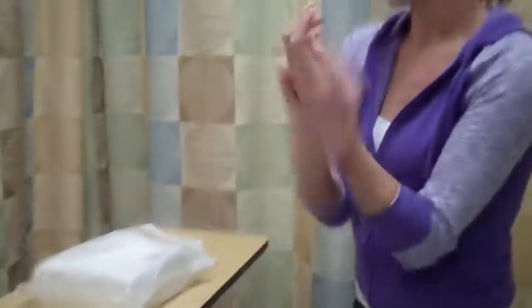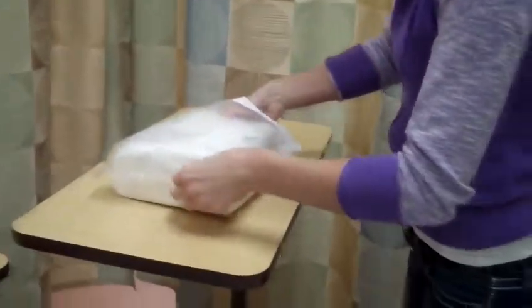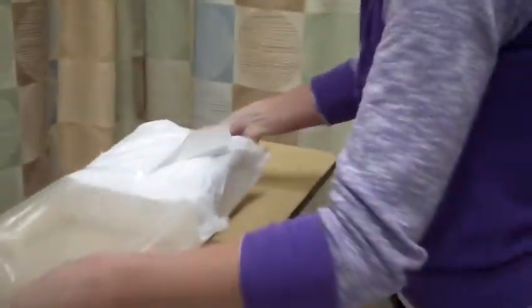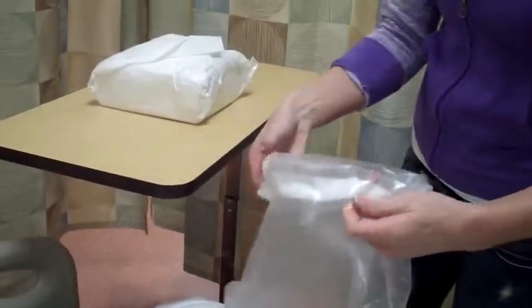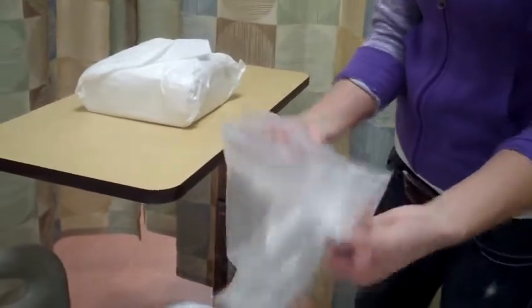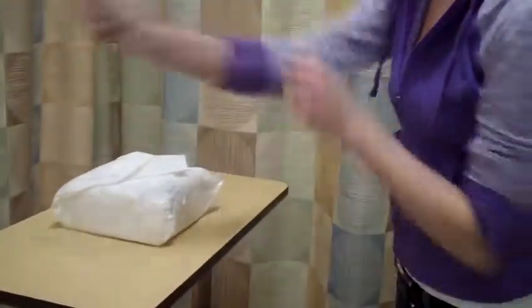And my hand hygiene. Go until there is no more urine coming out. Pull this out. And then actually use this for my trash. Hold and throw this away. Place that in a convenient location. Then don another pair of clean gloves.